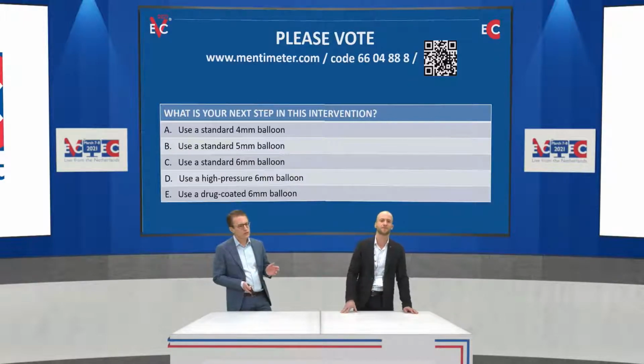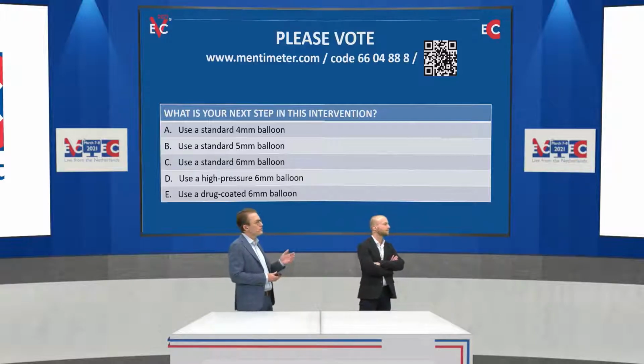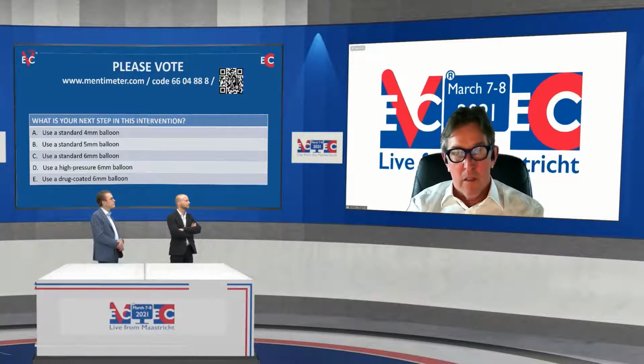So Jos, we discussed the issue of starting immediately with high pressure. Would you do that in this situation as well? Probably not. As you nicely showed with your graphs, a lot of lesions still open up with nominal pressure or rated burst pressure.